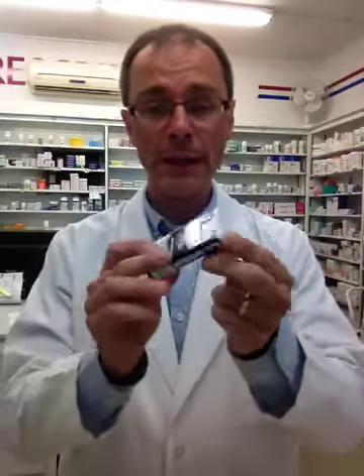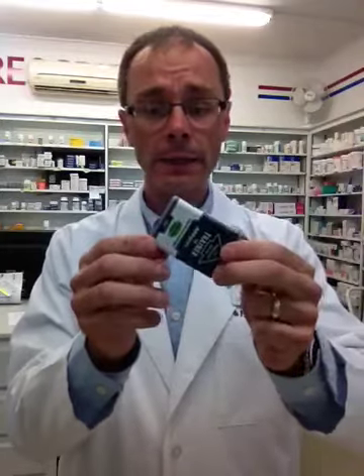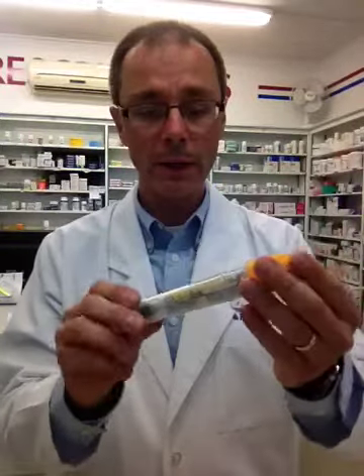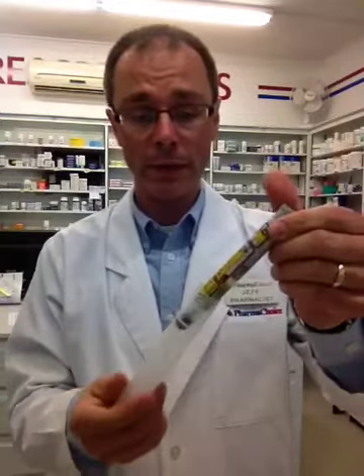The neat thing about the Allerject product — a couple of neat things — is first of all its shape. This is a trainer device which you can get online if you want to order one. The shape is kind of neat in that it's a little more convenient to carry. I compare it to about the size of a small cell phone and it will fit into a pocket or a purse probably a little more conveniently. They're both equally effective, but we're just looking at ease of transport right now.